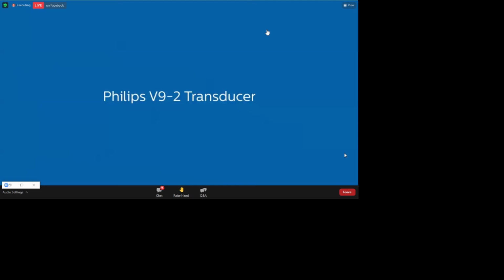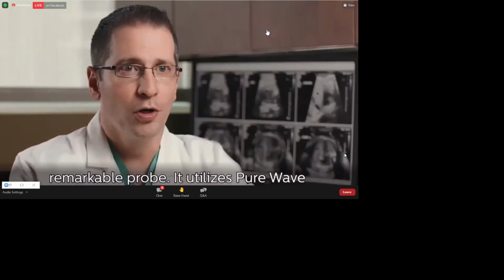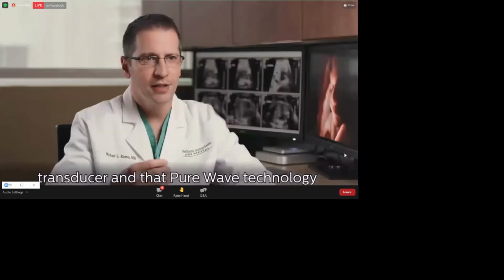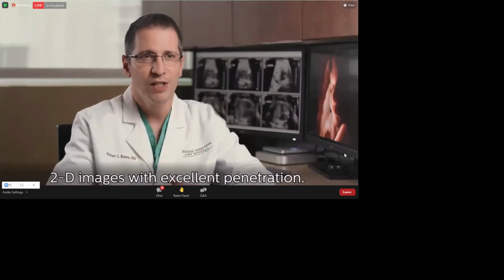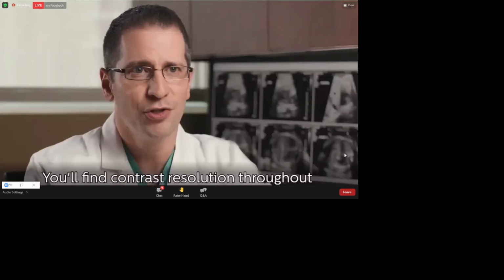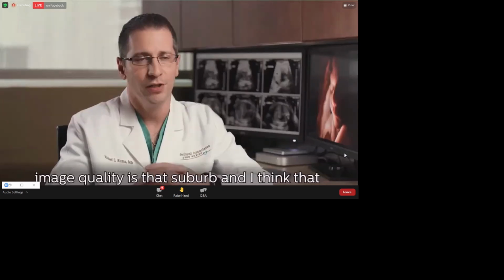The Philips V92 transducer, latest iteration in the 3D transducer family, really is a remarkable probe. It utilizes pure wave technology as an ultra broadband transducer, and that pure wave technology allows the probe to provide incredibly crisp 2D images with excellent penetration. You'll find contrast resolution throughout the entire imaging to be clear and concise. Really a single probe solution because the 2D image quality is that superb.